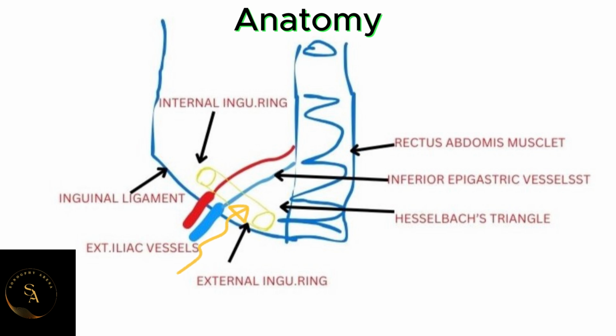The inguinal canal is a conduit located in the anterior abdominal wall muscle, which conveys the spermatic cord in male and the round ligament of the uterus in female. Also in this region is the inguinal ligament, which is a band of tissue that runs from the anterior superior iliac spine to the pubic tubercle.